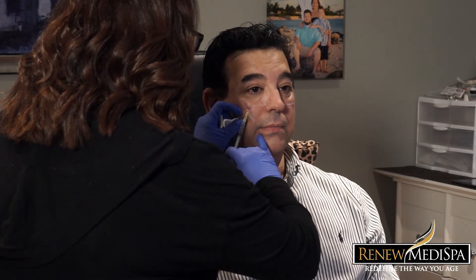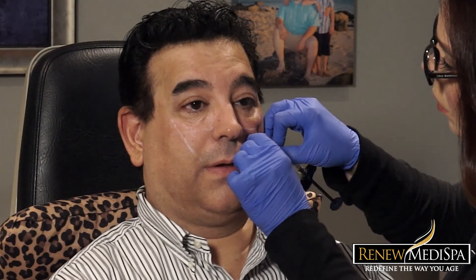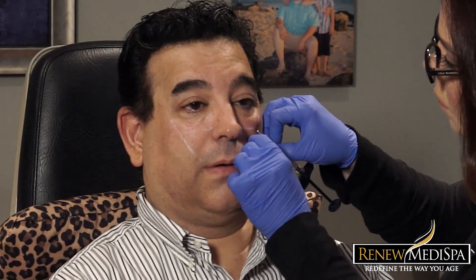Occasionally we'll do a tear trough procedure with platelet-rich plasma only if just a mild correction is needed or if that's the patient's preference. The procedure itself does not need to be uncomfortable at all. A very small area is injected with lidocaine, and from there I work with what's called a micro cannula. The micro cannula has really revolutionized how we perform these procedures — it enables us to enter through a very small pilot hole and move the cannula gently in various regions to deliver filler or platelet-rich plasma very comfortably.